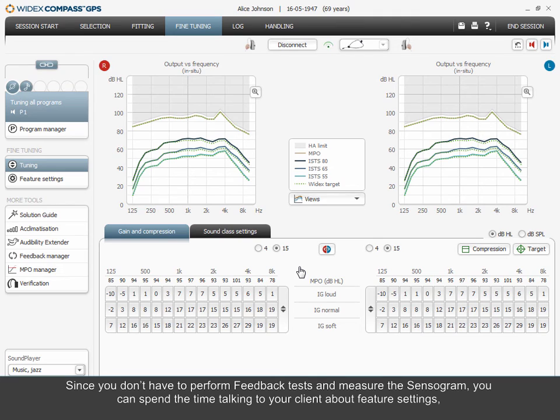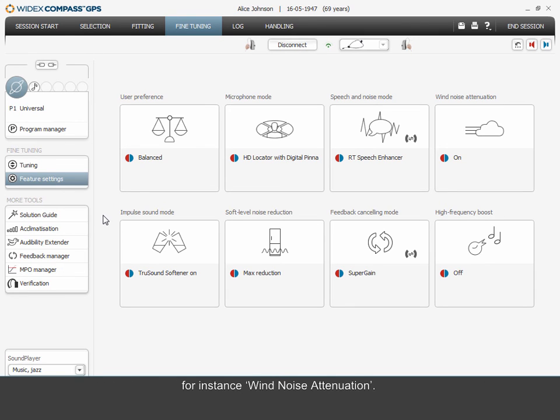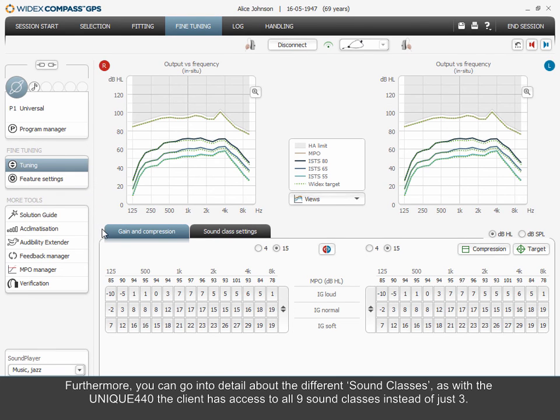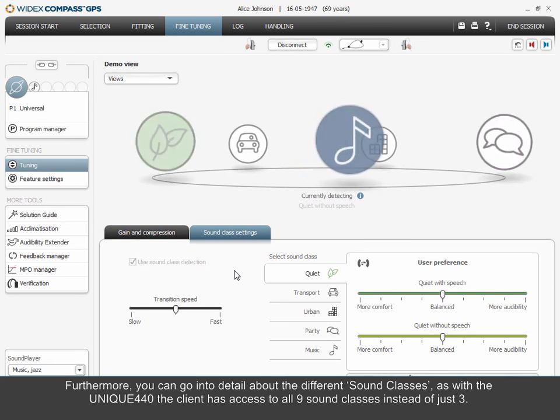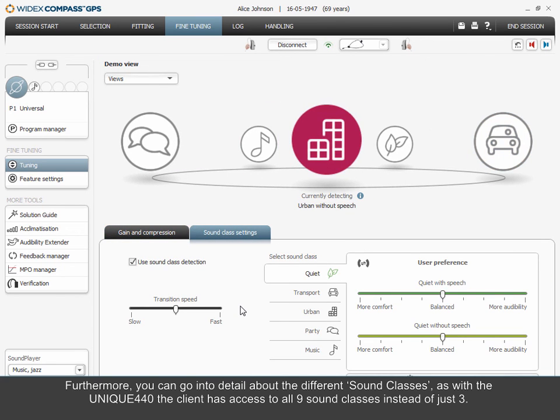Since you don't have to perform feedback tests and measure the sensorgram, you can spend the time talking to your client about feature settings — for instance, wind noise attenuation. Furthermore, you can go into detail about the different sound classes. With the Unique 440, the client has access to all 9 sound classes instead of just 3.